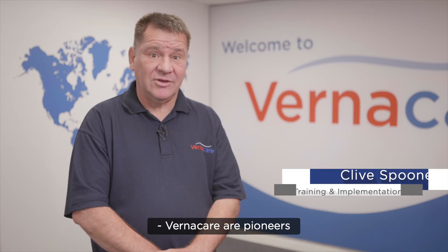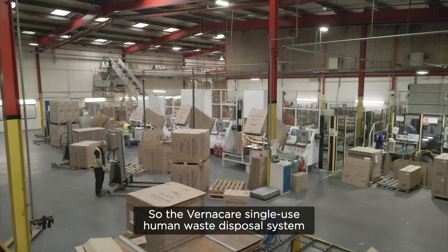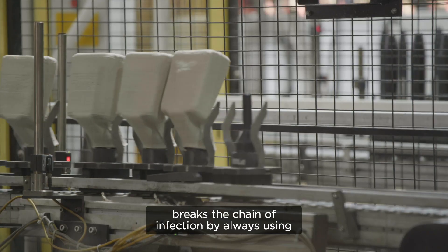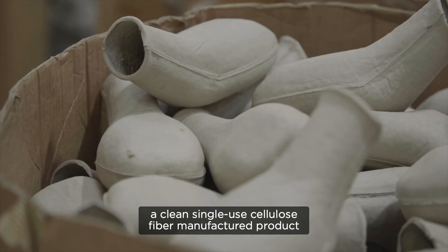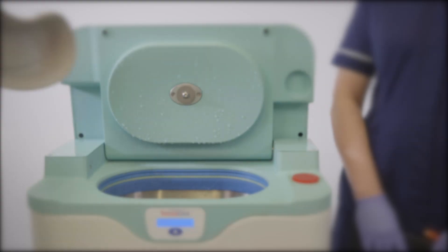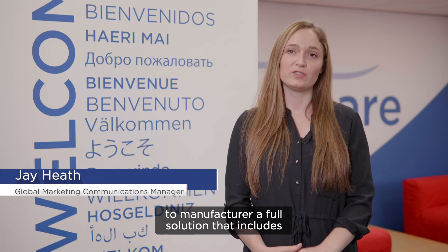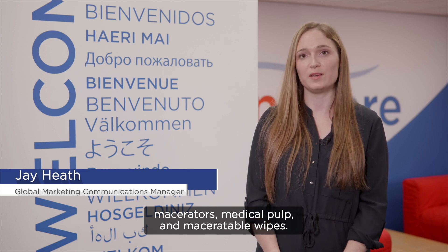Vernacare are pioneers of sustainable infection prevention solutions. The Vernacare single-use human waste disposal system breaks the chain of infection by always using a clean, single-use cellulose fiber manufactured product that will be disposed of cleanly and simply in a macerator. We're the only company in the world that manufacture a full solution that includes macerators, medical pulp, and maceratable wipes.